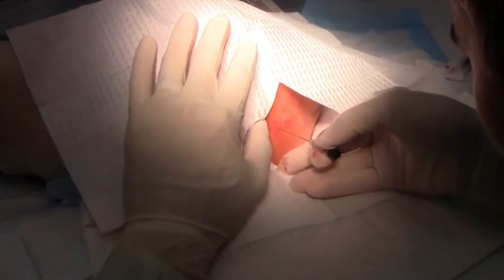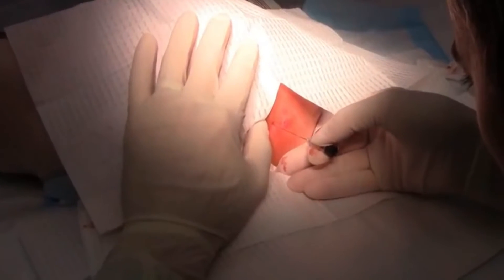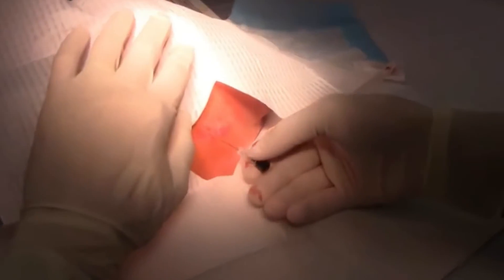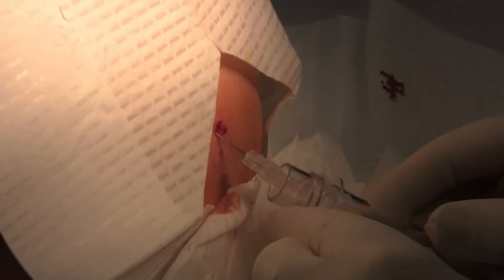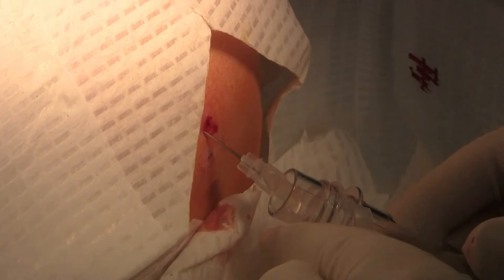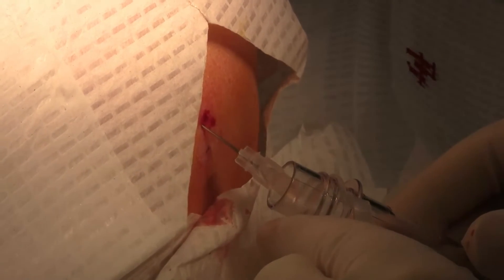With the landmarks identified, the operator carefully inserts the spinal needle between the vertebrae and into the subarachnoid space. Cerebrospinal fluid (CSF) is then collected into the collection tubes for further analysis.